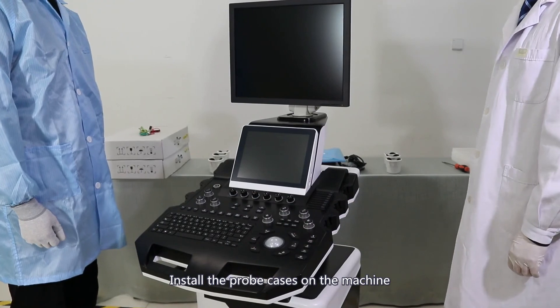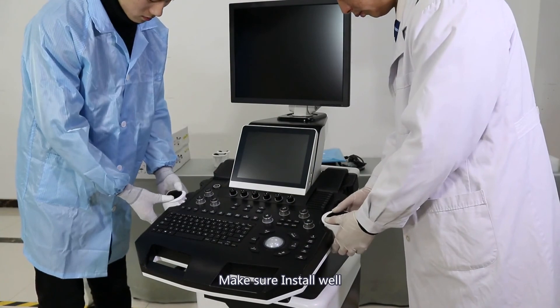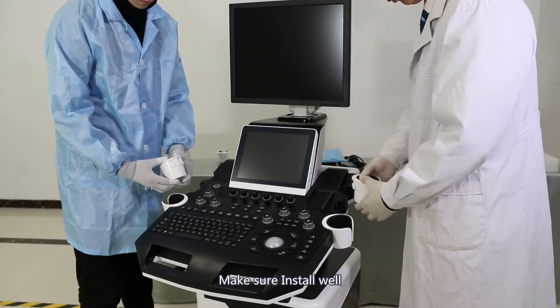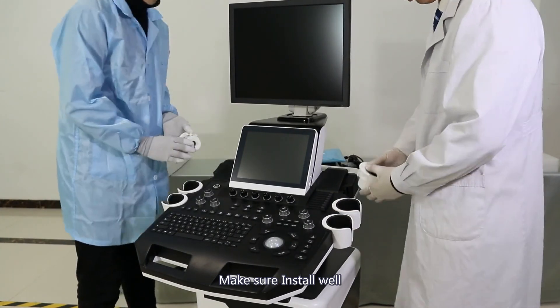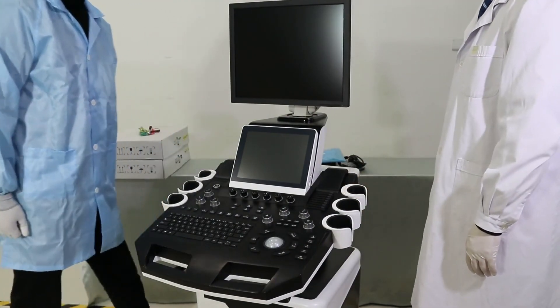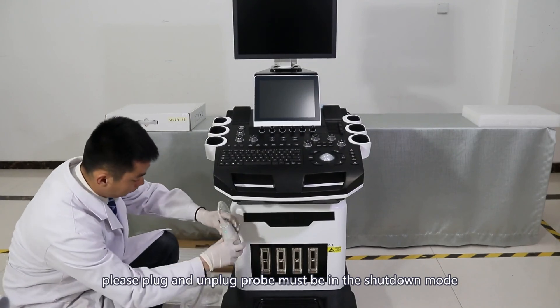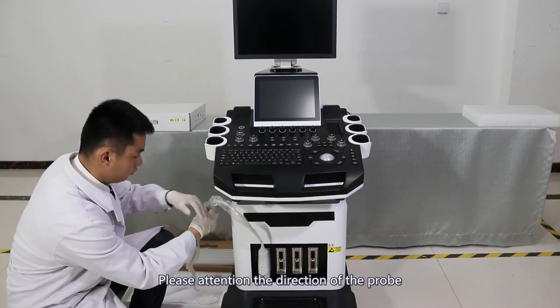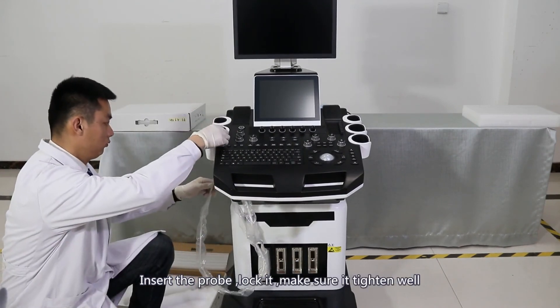Install the probe cases on the machine. Make sure to install well. About the probe connection: plug and unplug of the probe must be done in shutdown mode. Pay attention to the direction of the probe. Insert the probe and lock it. Make sure it is tightened.